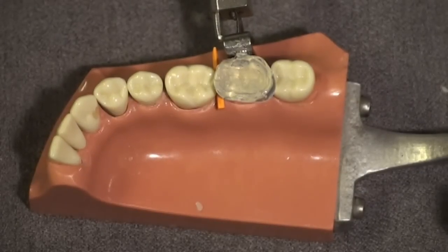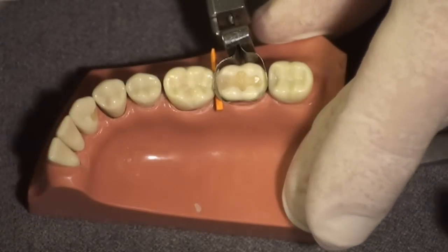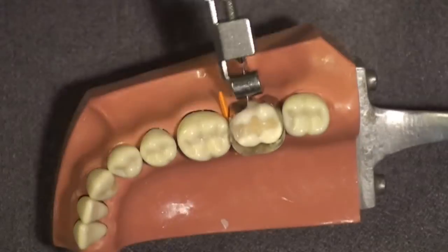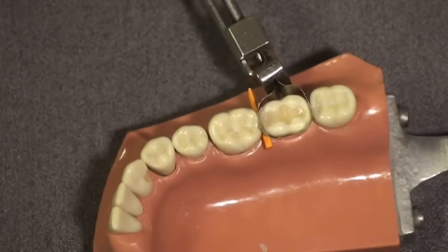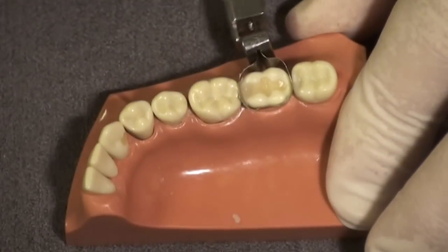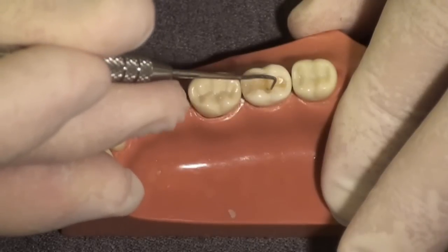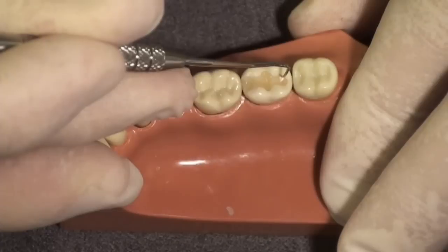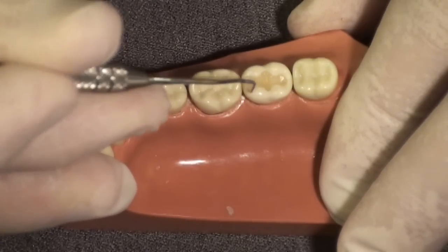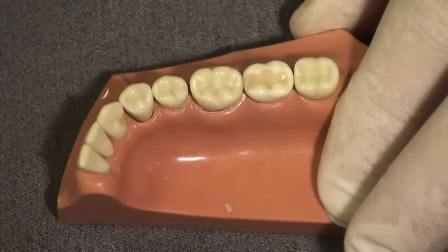I've cured the composite enough so that when I remove the custom matrix, the surface is hard and smooth and will not stick to the custom matrix. Now I'll show you what this looks like with no polishing, no finishing, no adjusting. Taking off the matrix band and the wedge — you can see we have a very smooth surface here. Sliding across the surface, there's hardly any catch at any of the margins, and there's a nice rounded marginal ridge. I have essentially saved myself any adjustment, finishing, and polishing of this restoration.